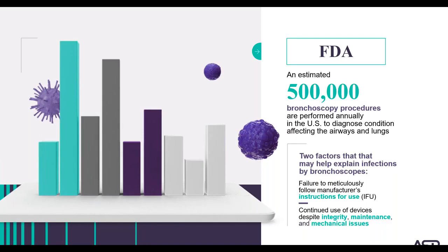And 2, using devices that are damaged. Now, being a seasoned OR nurse, I can tell you that ORs are notorious for having old bronchoscopes that may not have been used very often, but they're still in circulation. But just so you know that both time and how they're used may affect material integrity of these devices.